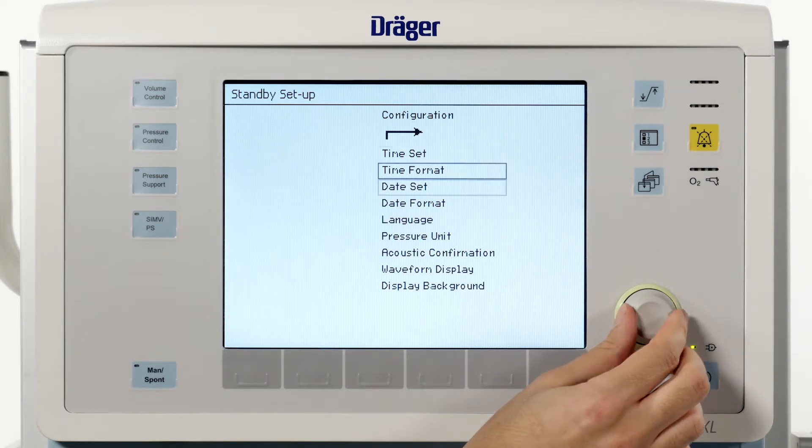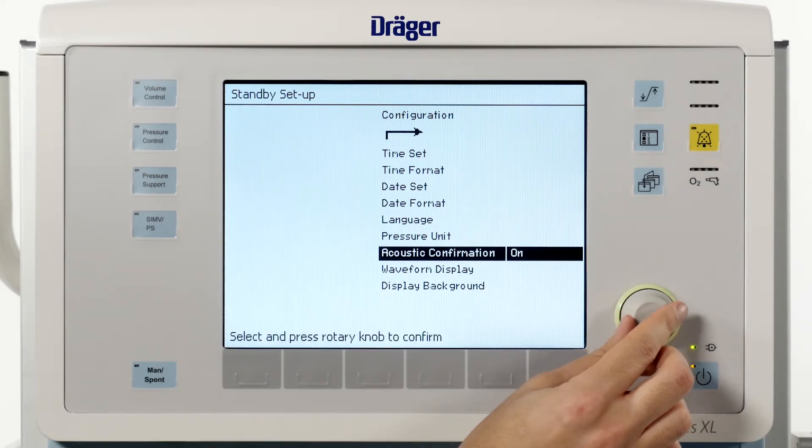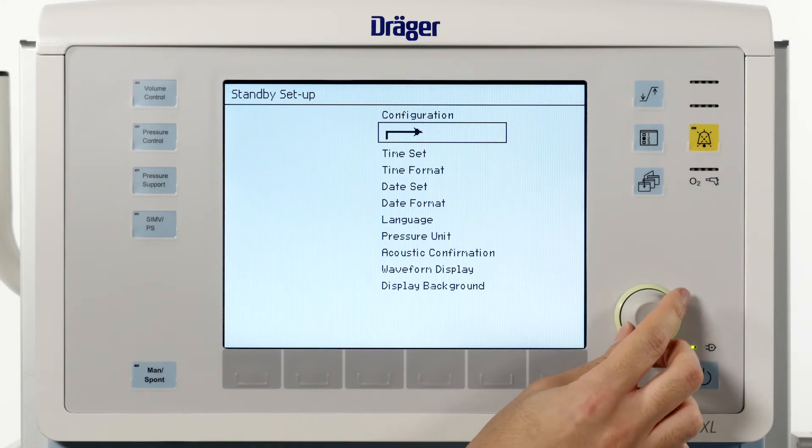If acoustic confirmation is set to on, a tone sounds every time the rotary knob is pressed.